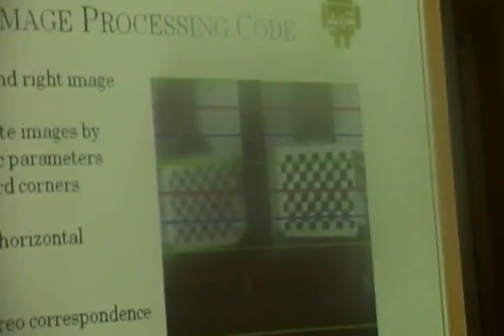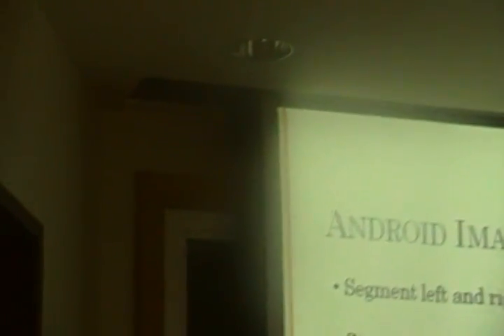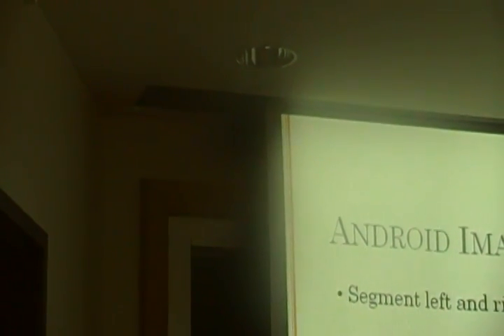The distance between those images in terms of pixels will be used to compute our disparity. So we do this over all the pixels in the image, and we come up with a disparity map. And then from that, we just crop it and resample it to an 8x8 integer matrix, which we send to our vibrotactile array over Bluetooth.